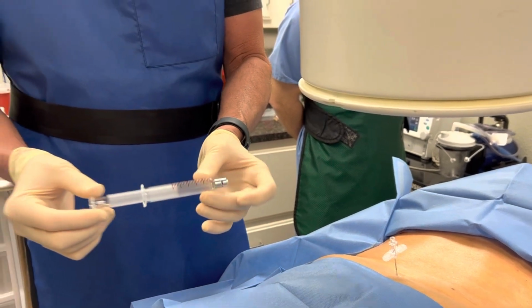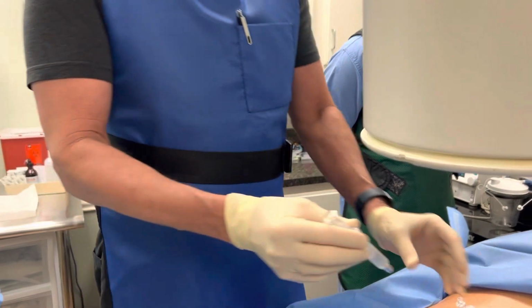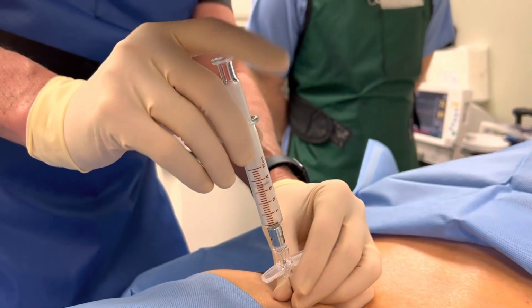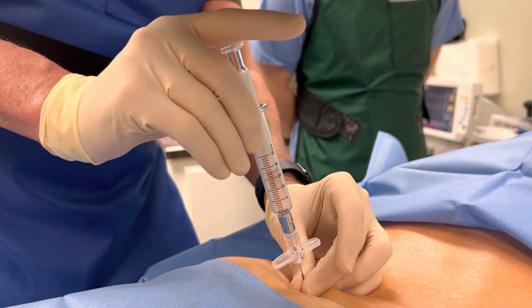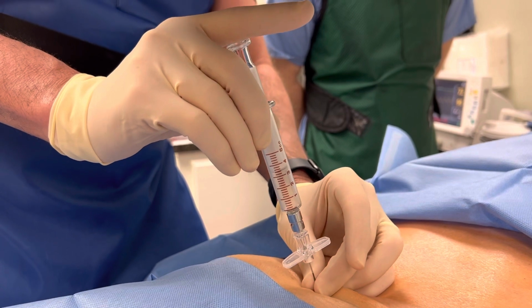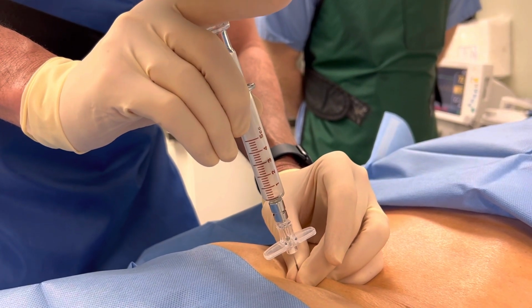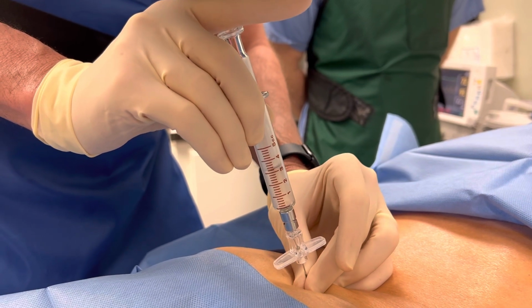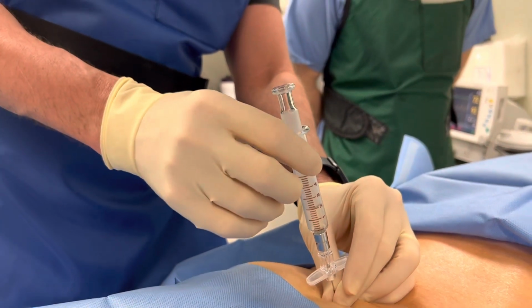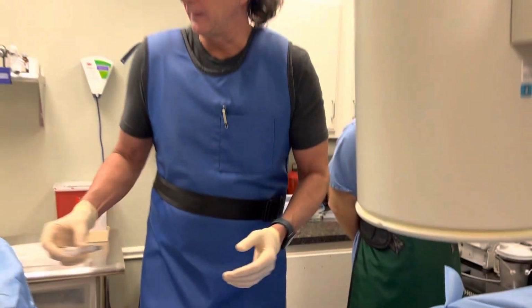This is the syringe. It's a glass syringe. There's nothing in it, just air inside of it. I'm going to put about 3 or 4 cc's of air, and I'm going to put it on the syringe and lock it down. Now, if I'm in ligament and that needle's stuck in the ligament, when I push on it, I'm going to get resistance. So I'll keep gradually pushing the needle down, just millimeter by millimeter, and pushing on this until I puncture through the end of that ligament, and now I've lost resistance. So that tells me I'm in the space called the epidural space, which is where we want to be.